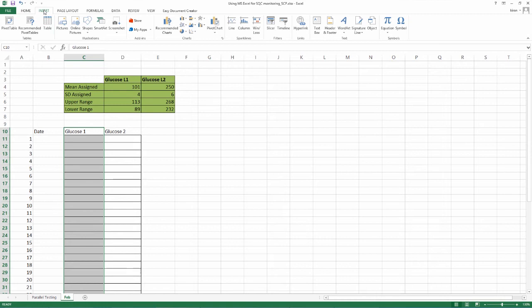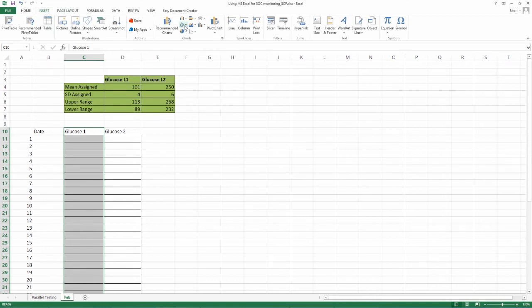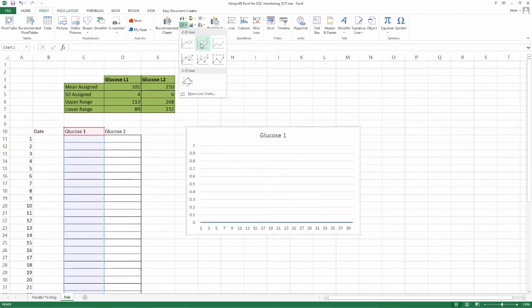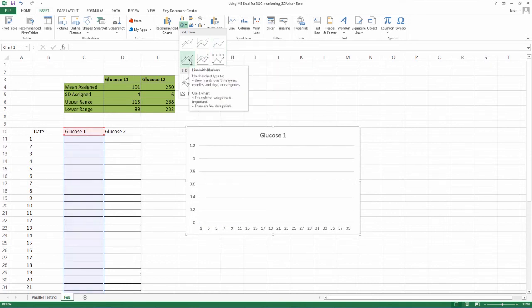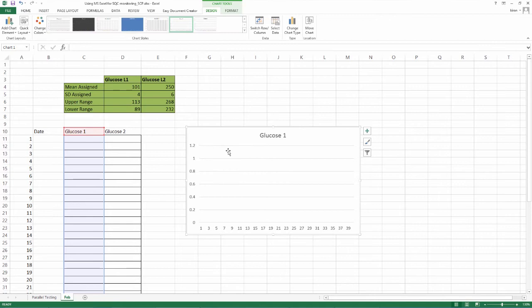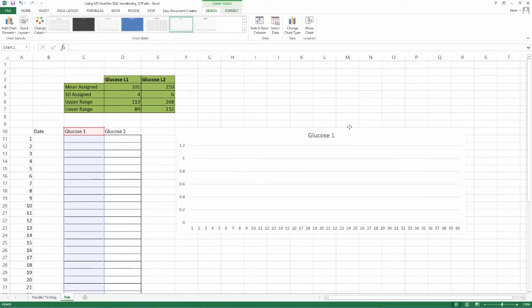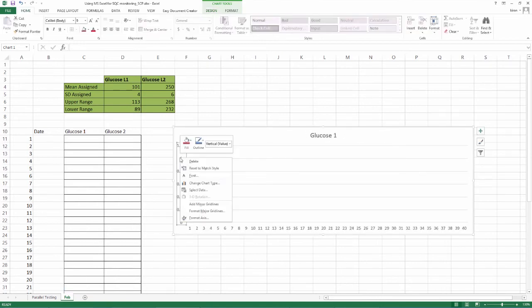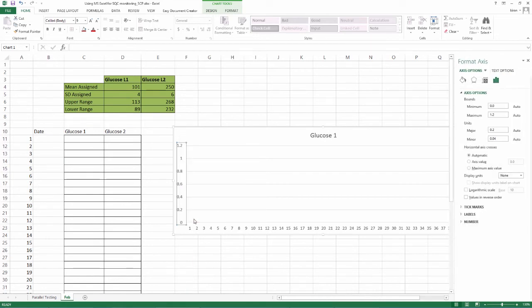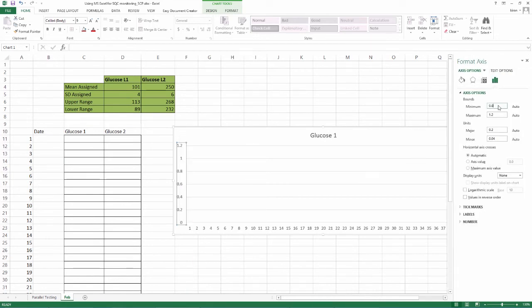Now, select all rows in that column starting from glucose 1 to serial number 40. Go to insert, charts, line graphs. You may select any line graph. Here, we are selecting this option, line with markers and click. A graph labeled glucose 1 appears. Now, click on the Y axis to adjust the mean and SD as per our need. Select format axis option and click. Under axis options, select fixed, not auto.